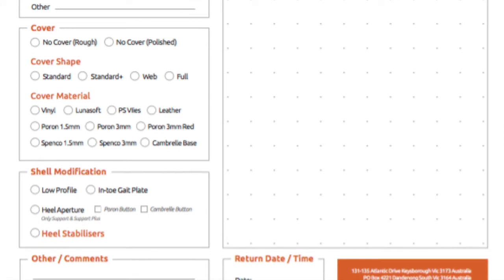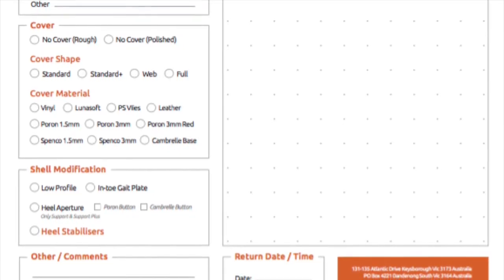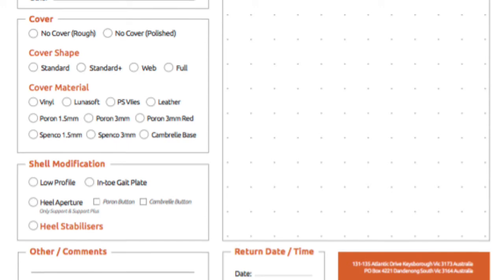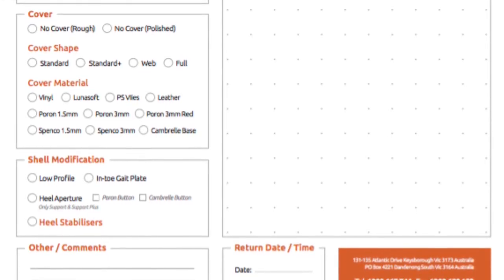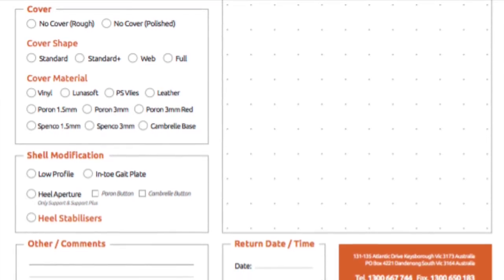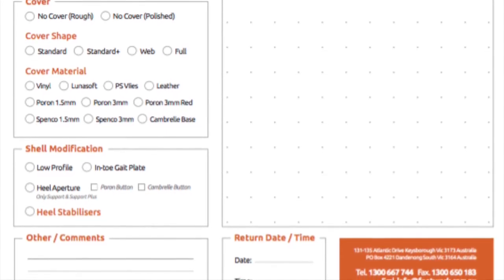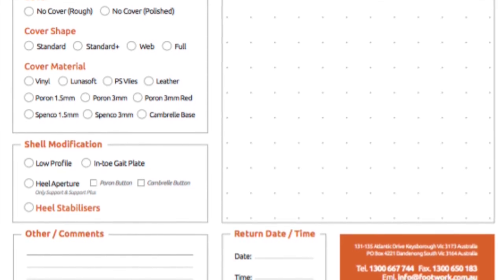These include the low profile grind into gait plate, which is a lateral extension of the polypropylene that encourages external rotation in those with in-toeing. Other modifications include heel apertures, which are often used to cushion and accommodate the medial tubercle of the heel, particularly with those with heel pain or painful heel spurs, and heel stabilizers, which stiffen the orthotic arch and reduce side-to-side and forward movement of the orthotic in the shoe.